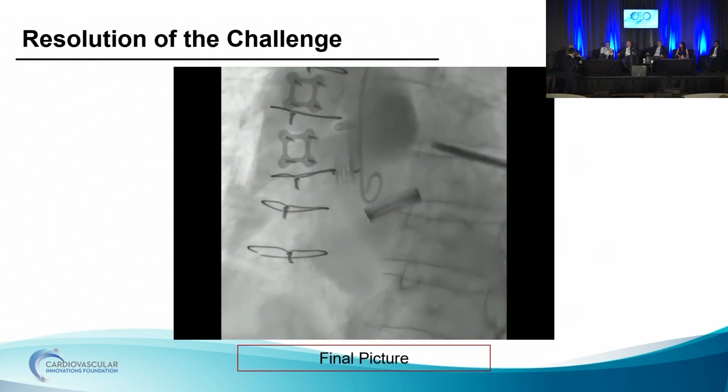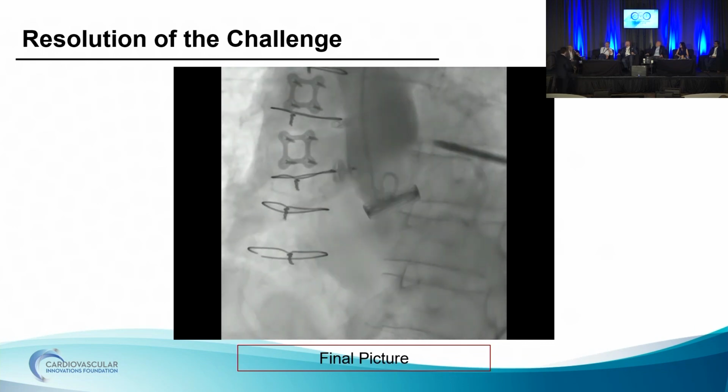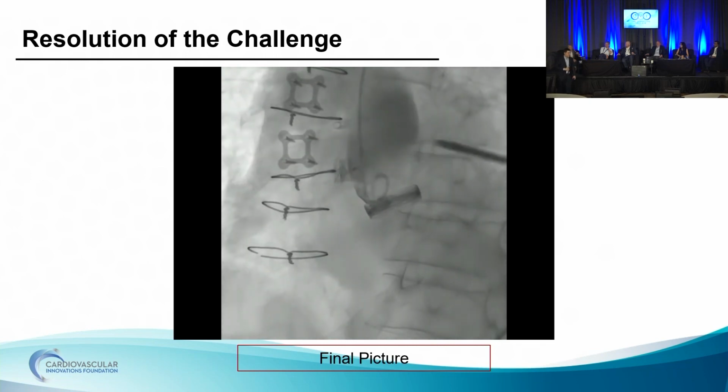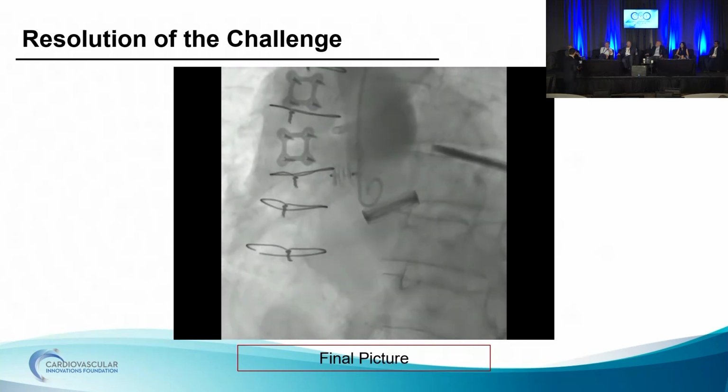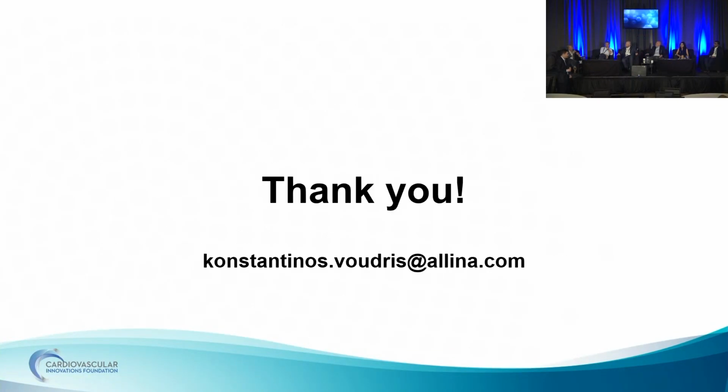It's great. That is great. Yeah, I think we were hoping for a T-stent like approach, with the plug as the part of the T-stent. But because the CT suggested that the origin of the pseudoaneurysm was off the native right, that it was not shared, positioning that plug, there was no way the plug was going to stay in the coronary artery. It was just too hard a position, but it turned out great. That did turn out really nicely.